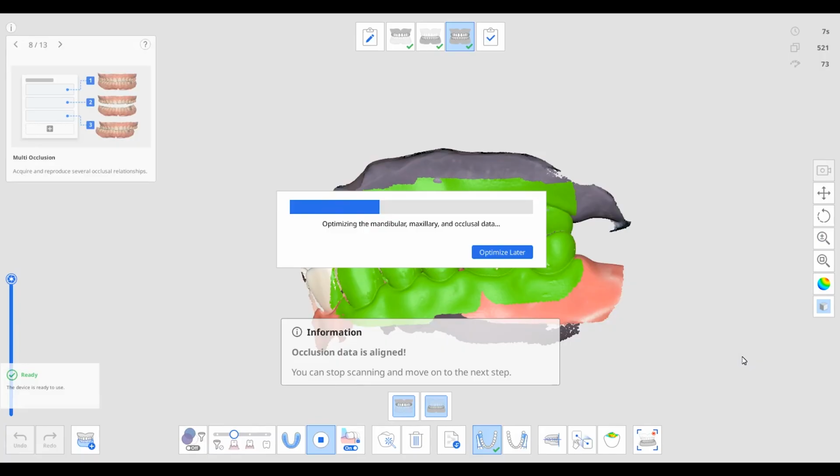Another situation where you'd be able to use impression scanning is if you take a triple tray impression. Maybe your patient is in a hurry to leave and you're still waiting for your intraoral scanner to free up. If they really have to leave, just take a quick physical impression using a triple tray, capturing all the necessary information, upper, lower, as well as the bite. Send your patient on the way, and then once your scanner is good to go, you can scan both the upper and lower information off of the triple tray and also extract the bite from that same impression. Let me show you how that would go.